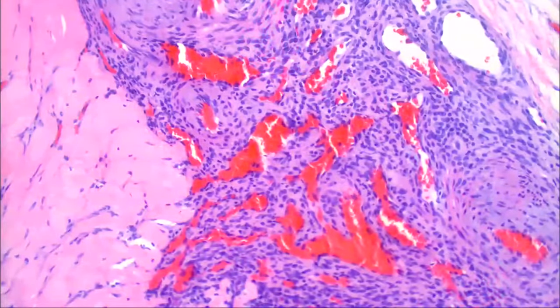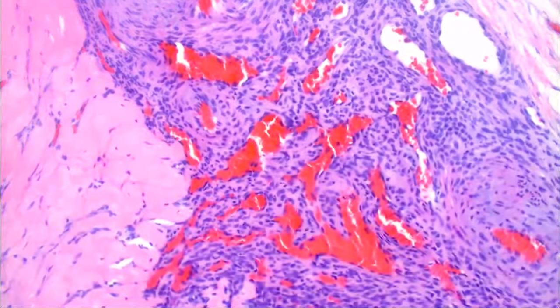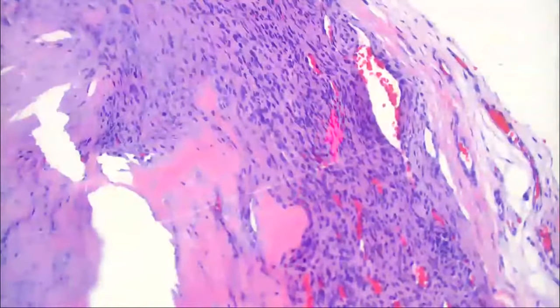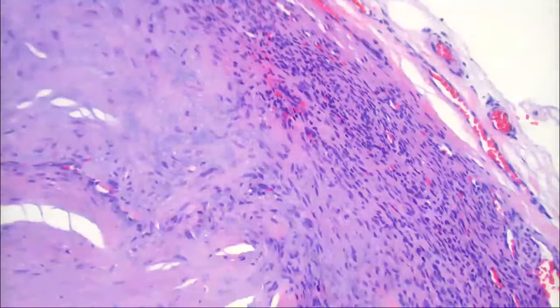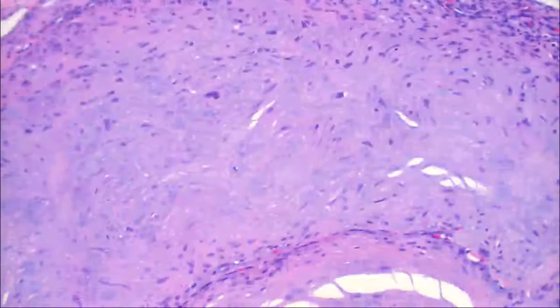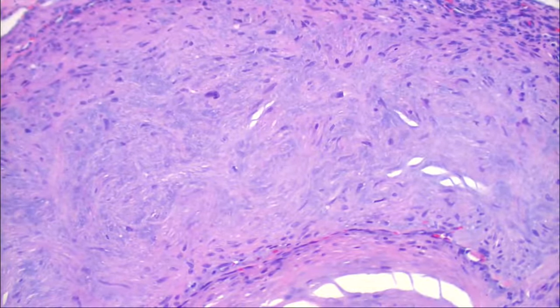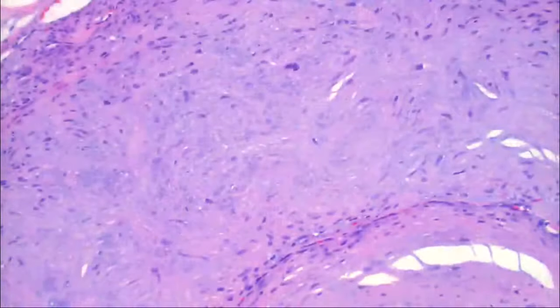And then notice here, here's kind of a large blood vessel with a thick wall. It's probably an arterial wall with smooth muscle, or there's another type of cell that's similar to smooth muscle. What is another type of cell that's similar? And you can see it kind of blends imperceptibly into this component. Skeletal muscle, but it wouldn't be spindled, I don't think. The other things I think about are fibroblasts when I think about spindles. So what type of fibroblast is kind of like a hybrid between a garden variety fibroblast and a smooth muscle cell?